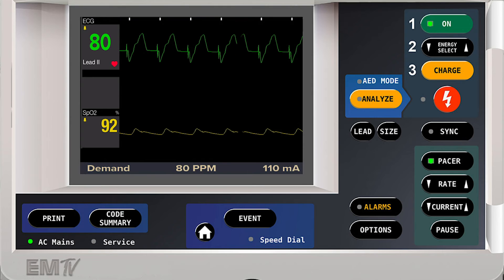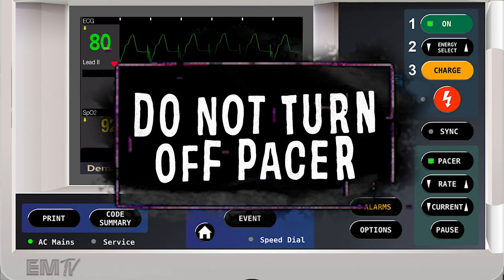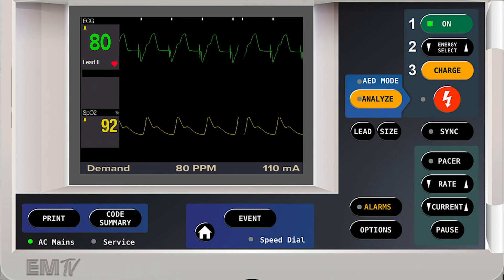The current window will disappear on its own in a few seconds. Because we have successfully paced this patient, it is imperative that you do not turn the pacer off. Any additional changes to the current or rate can be performed by simply pressing those appropriate buttons.